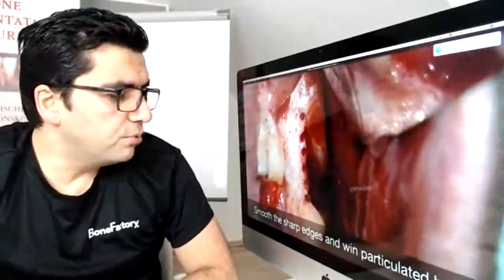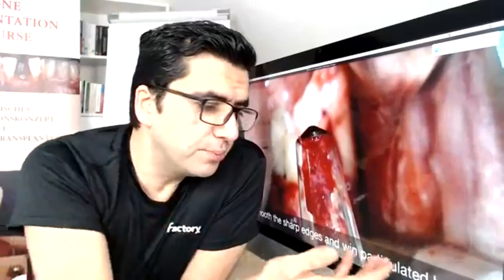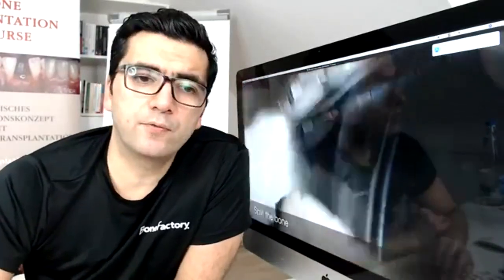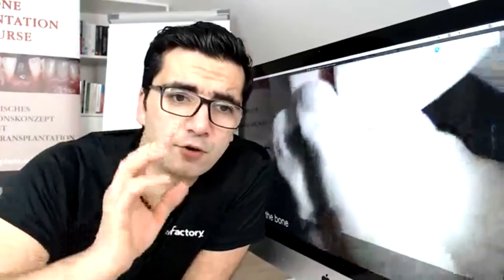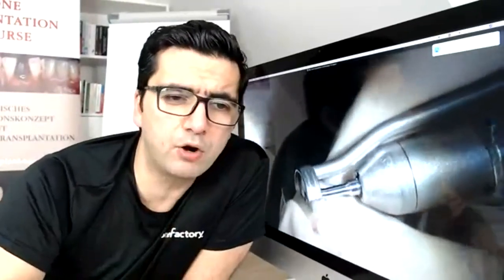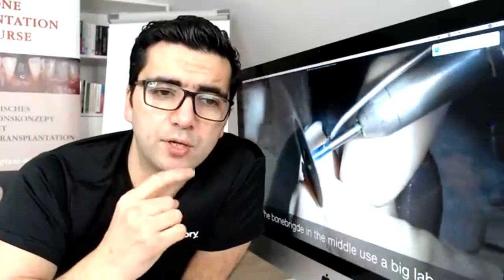The next step is using the bone scraper to smooth the sharp edges in the area — not only to smooth, but also to collect particulate bone for the augmentation. The next critical part of the protocol is the split bone block technique. This is a very important part. If you forget this part, you go directly outside of our concept.